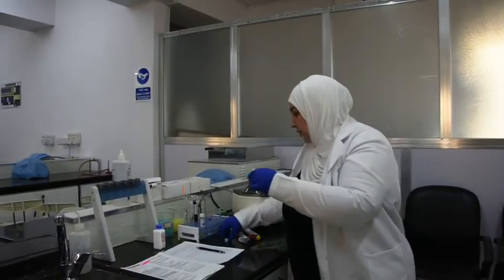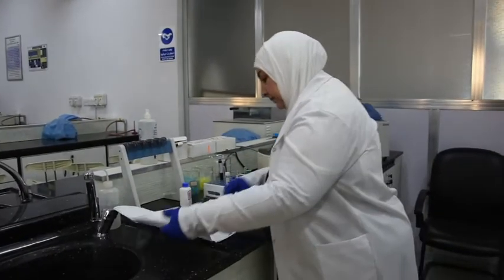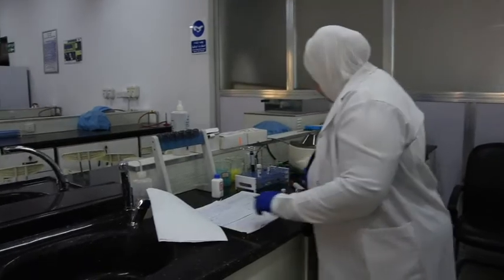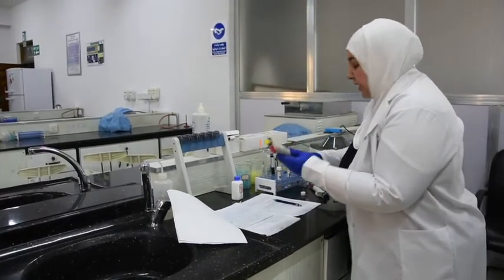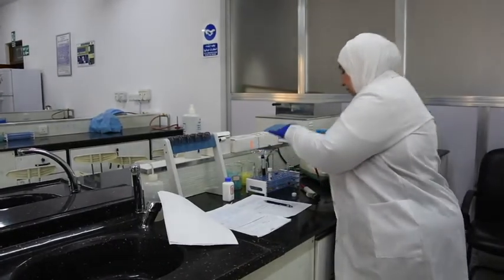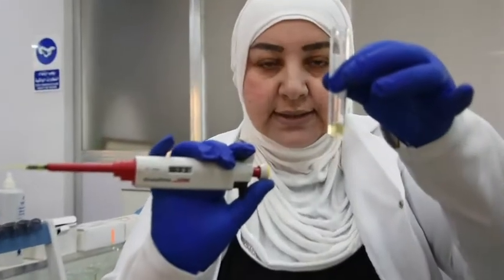Then we need to take 100 microliter of the supernatant only. You see, 100 of the supernatant only.